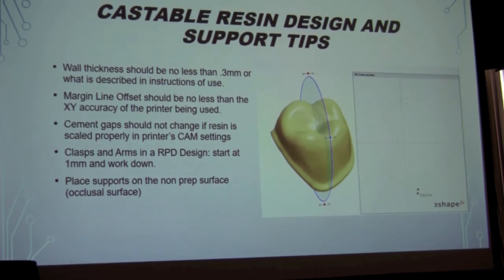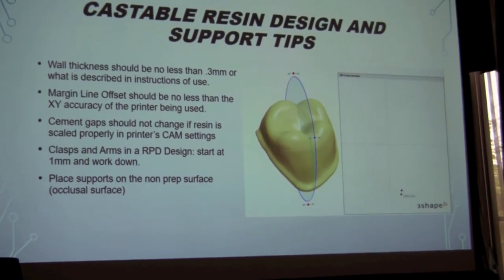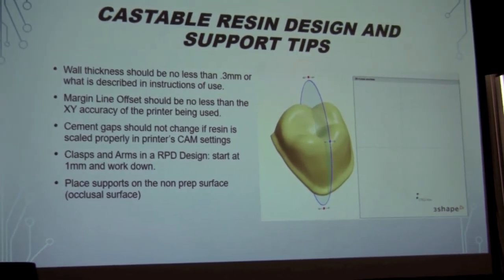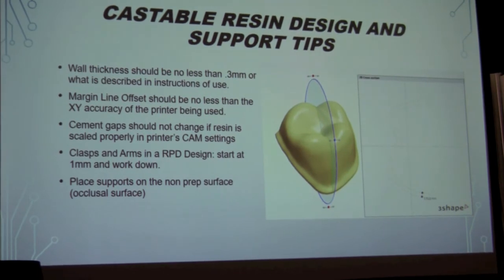Cement gap should not change if the resin is properly scaled in the printer's CAM software. So if we already have a preset scale factor in, you should be able to use the exact same settings that you're already using for your crown and bridge applications.